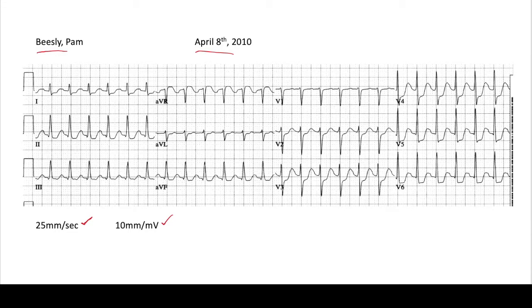The first thing we look at is rate, rhythm, axis. Starting off with rate, just by quickly looking at this, we see that this is a pretty fast rate. So the best thing to use with a fast rate is the box method, not necessarily counting. Looking at lead one, the QRS complexes are pretty close to the big boxes at the beginning. So we count big boxes: one, two — there's two big boxes between the QRS complexes. So this would be 300 over two, or 150 beats per minute.